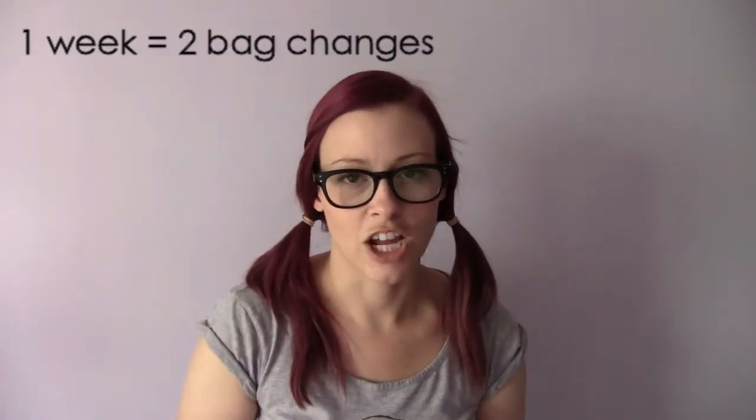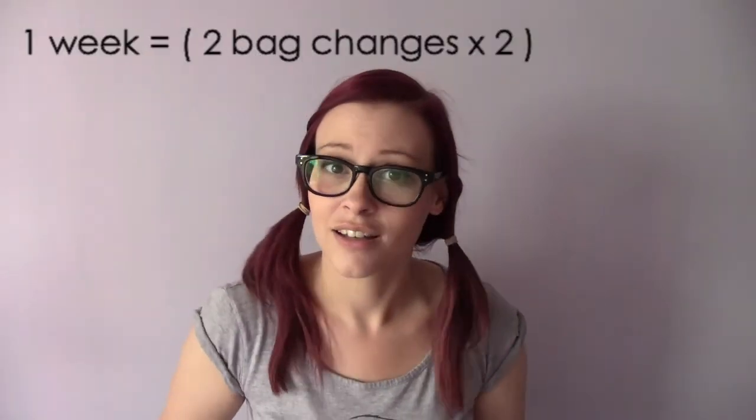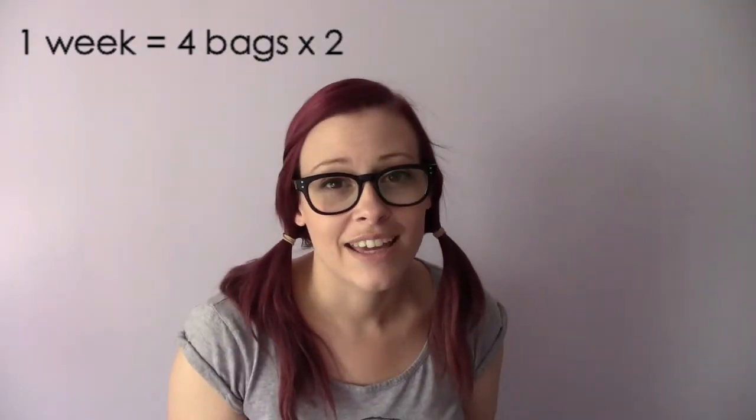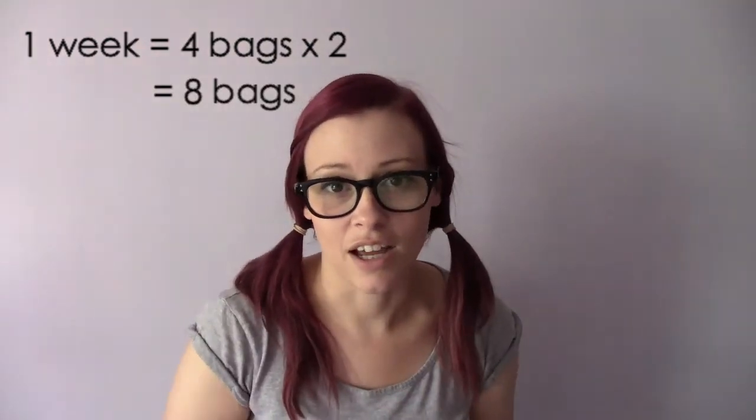So I went away for a week, and in a usual week I'll probably change my appliance twice, but I have 2 bags, so that would be 4 appliances. Then times that by 2, so I've definitely got enough for the week plus a bit more. So if I take 8 bags plus all the accessories, I know I'll be covered. And if there's some kind of travel issue and I'm there a bit longer, or if I have more leaks than I usually would, or any leaks at all, at least I've got enough to replace the ones I use up. So I've definitely got enough to last the whole time I'm away.